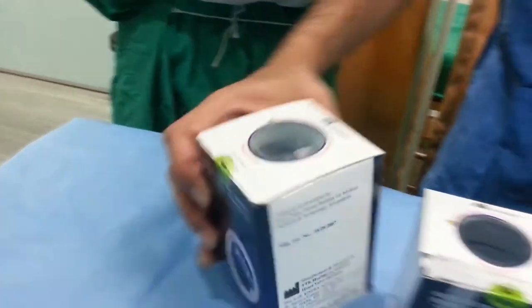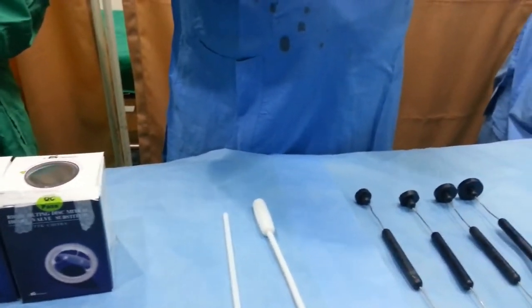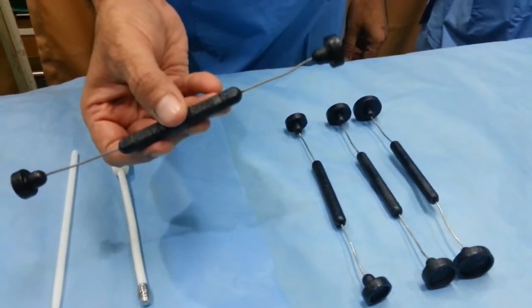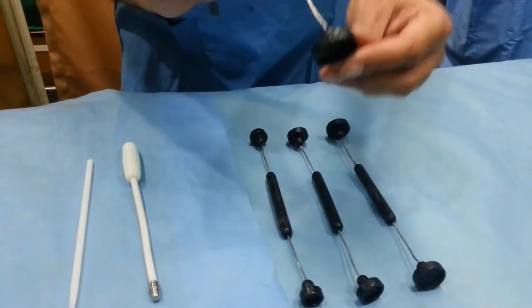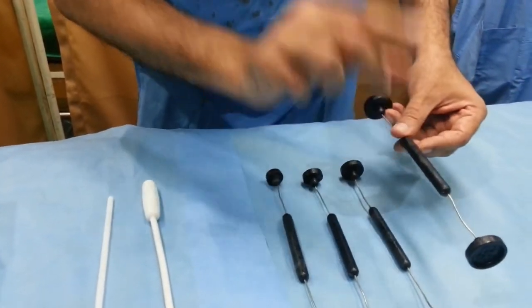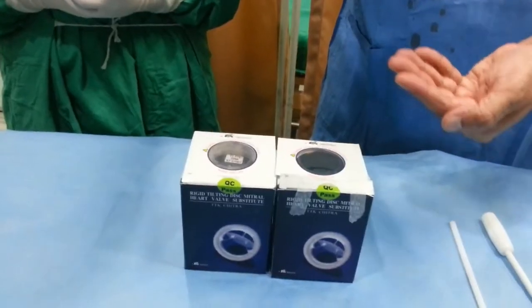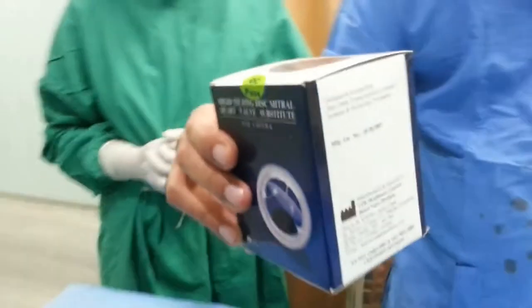Right? Now, once the operation is going on and the patient has been on pump, cardioplegia given, and the mitral valve has been excised, the surgeon will size the valve using one of these sizes, and he may say he wants, say, a 29 sized valve. Once he decides on that, he is going to say, please give me a 29 TTK Chitra quickly. Once he says that, pick up the 29 Chitra TTK.